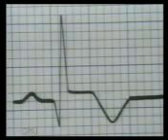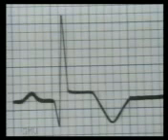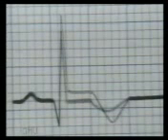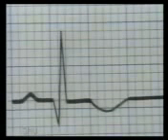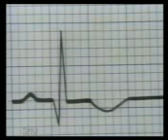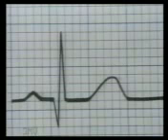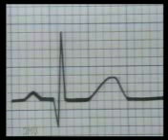The T wave is typically pointed and inverted with symmetrical limbs. In the third week, the Q wave will become fully developed and the T wave will gradually become flat and start returning to normal. By the end of 3 months, the ST segment and T wave will return to normal and only the Q wave will remain permanent.